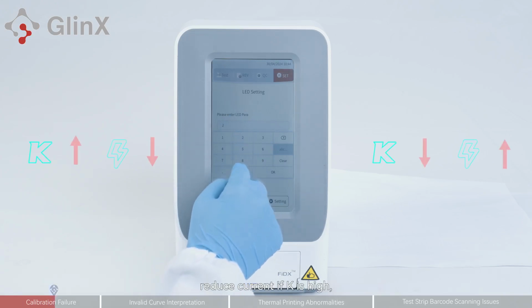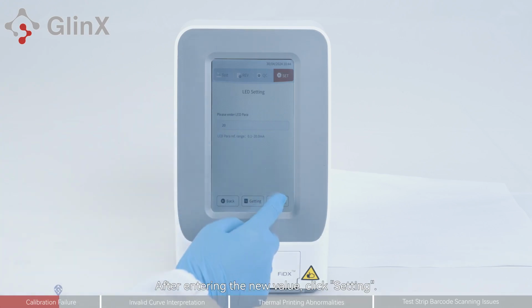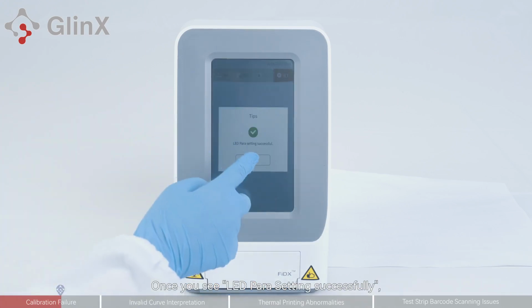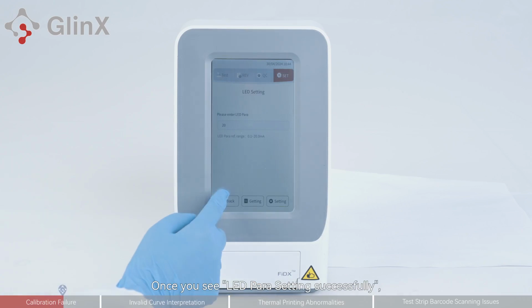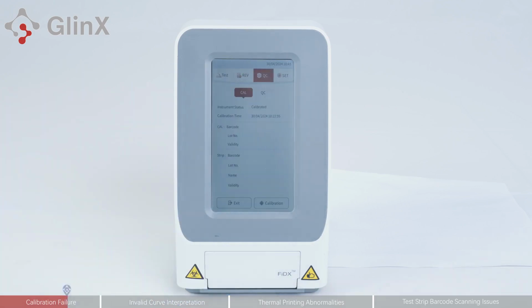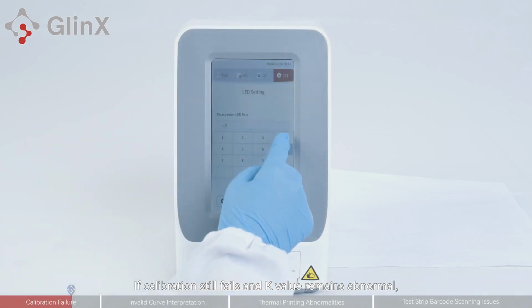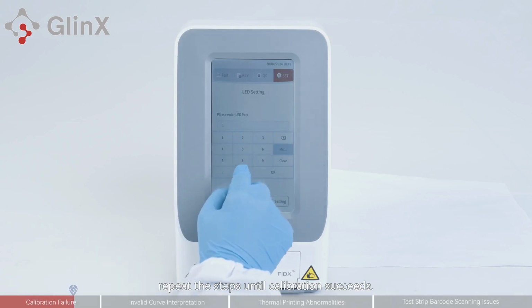Reduce current if K is high. Increase current if K is low. After entering the new value, click Setting. Once you see LED para setting successfully, return to the QC interface and recalibrate. If calibration still fails and K value remains abnormal, repeat the steps until calibration succeeds.